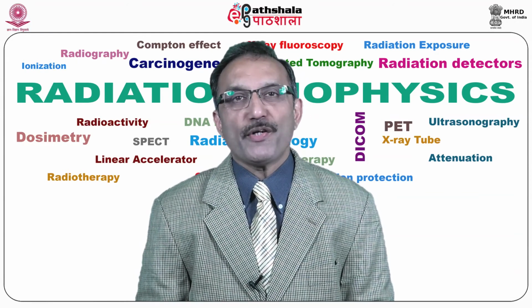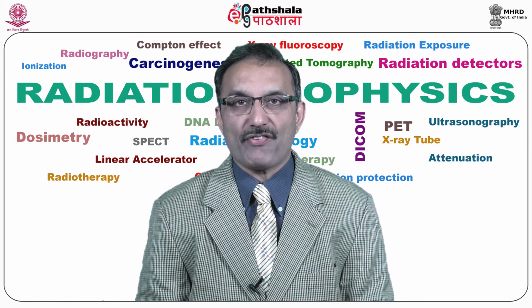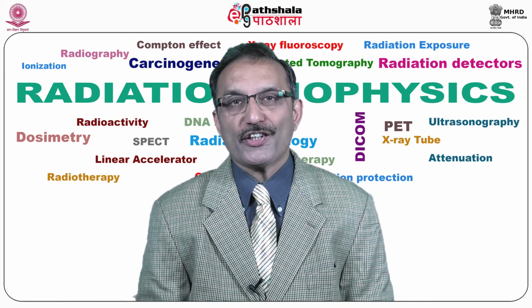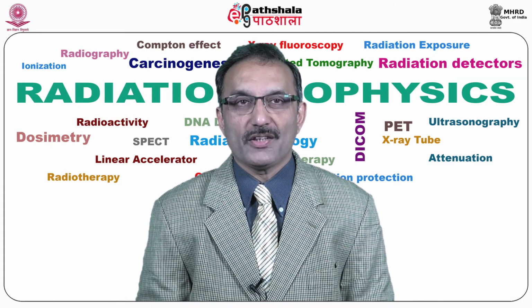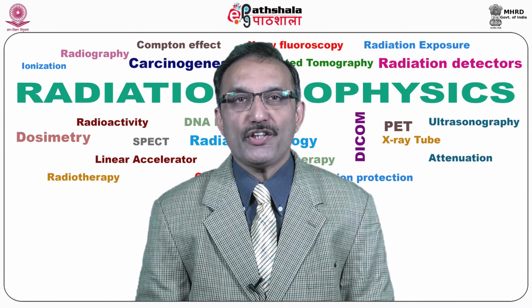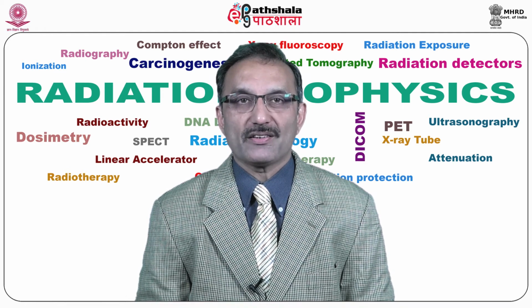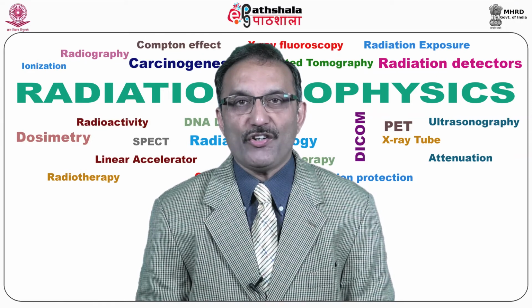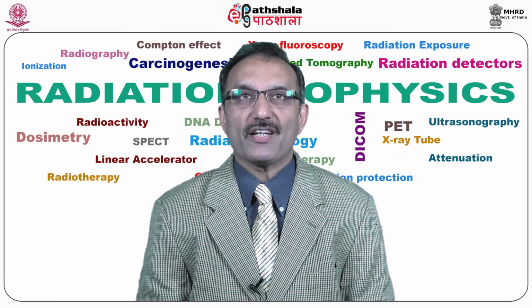A radiopharmaceutical is generally made of 2 parts, which we'll see in the further slides. First is a pharmaceutical that targets a specific organ or tissue, and a radioactive material, called a radionuclide, that gives us small amounts of radiation. It means a radiopharmaceutical is a combination of a pharmaceutical and a radionuclide. The pharmaceutical part acts like a chemical that the body normally uses, so the body tissues take up the radiopharmaceutical. The radioactive part gives off the radiation, gamma rays, that is detected by a special device.